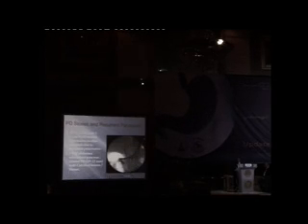And when we did the CT scan, it showed the pancreatic duct to be dilated with calcified objects. And when we did the ERCP, there are two large stones here, one in the tail and one in the mid-body, with a significantly dilated pancreatic duct. So we did pancreatic sphincterotomy with balloon dilation up to 8 millimeters.